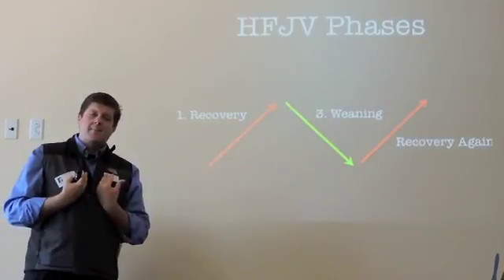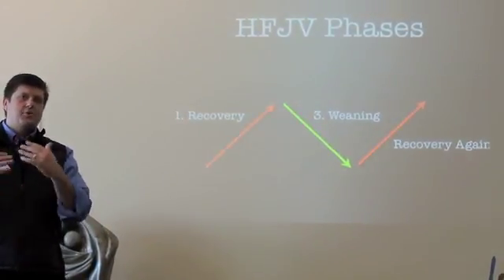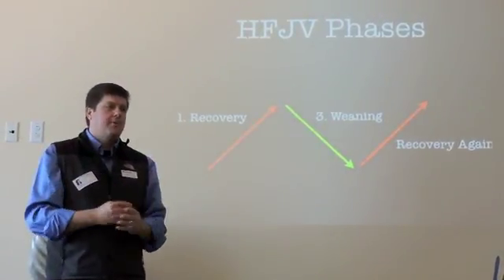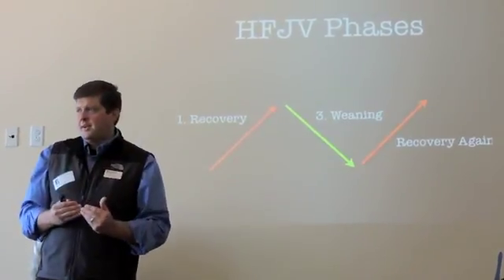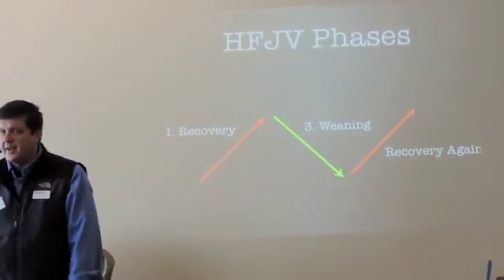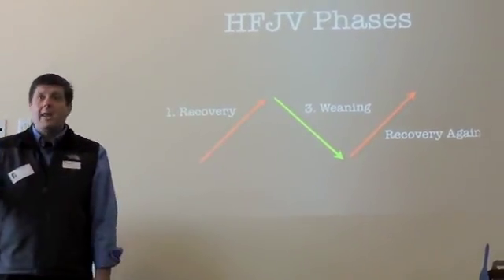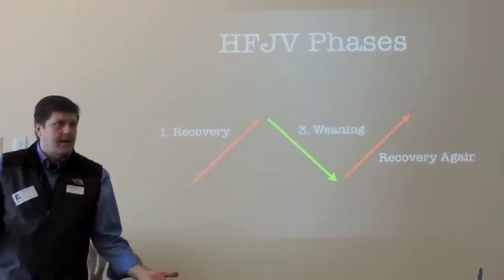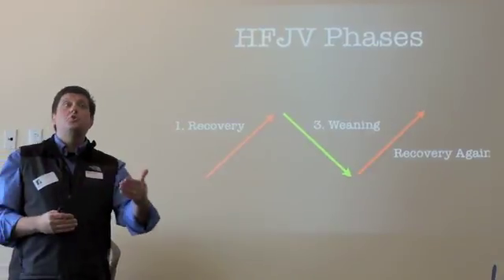But my idea is, when I finally get a good blood gas, if my CO2s were in the 80s, 90s, and finally I got everything tweaked and I finally have a good blood gas, to me, that means do nothing. That means your current ventilator settings are giving you a good blood gas. Because if I wean after finally getting a good blood gas, my CO2 is going to go right back up again. Now, you can wean when the blood gas becomes a little too good.